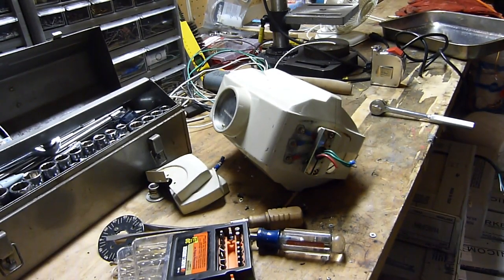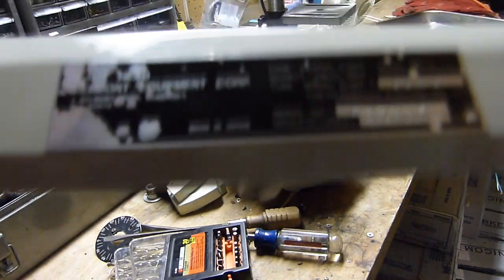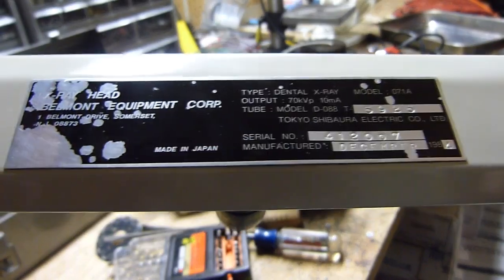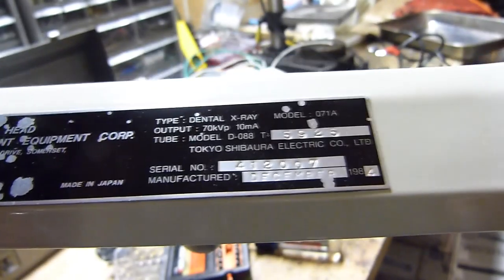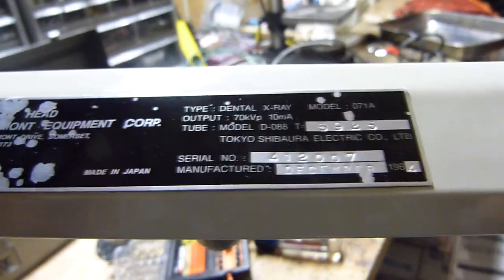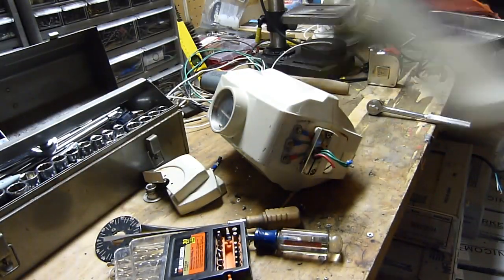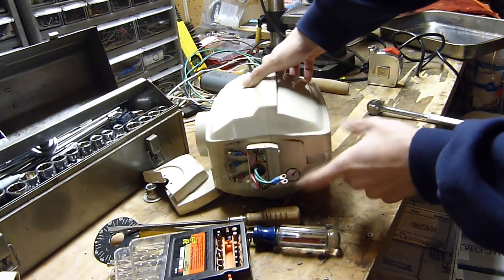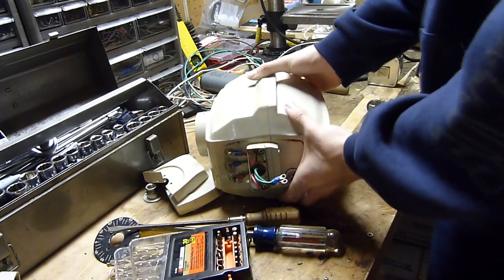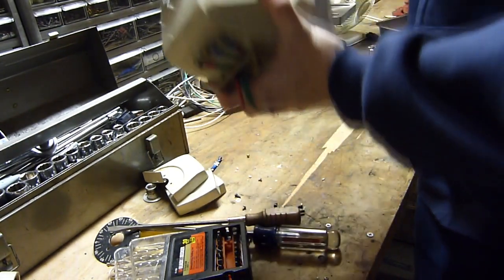Alright, I'm going to take apart this little dental x-ray unit. Here's the tag information — it's made by Belmont. It's got a total output of 70 kilovolts at 10 milliamps. I already took off the mounting bracket, and it looks like this unit actually has a drain plug because these units are filled with oil to insulate all the electrical high voltage inside.